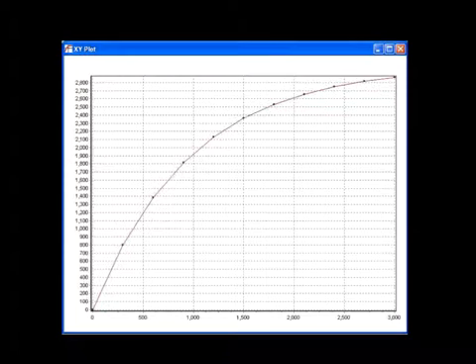So for example, could somebody maybe estimate the buildup constant here from this curve? Somebody want to take a shot at that? Let's assume this axis here is in seconds, and this is the polarization. I'm actually not sure of the number here myself.